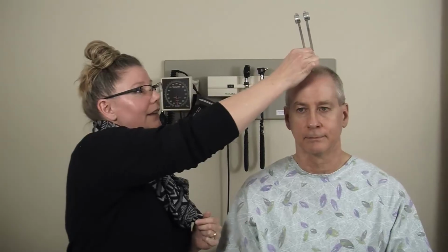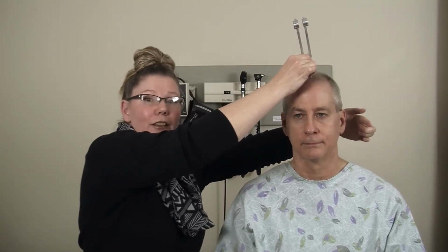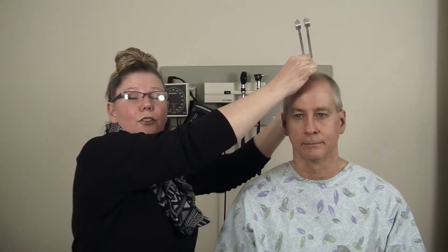Again, if Steve has a hearing loss in the right ear, and I do the Weber test, and it lateralizes to the good ear, what that tells me is he has sensorineural hearing loss in the right ear.